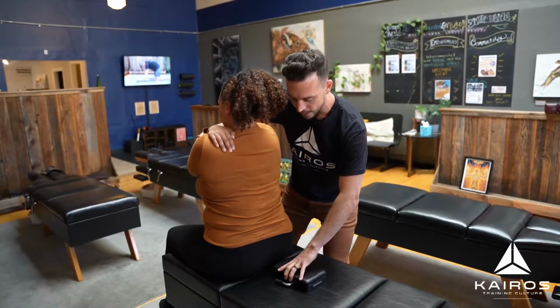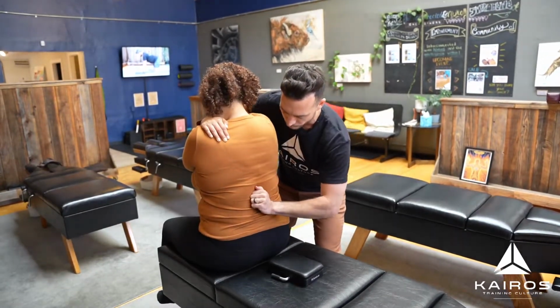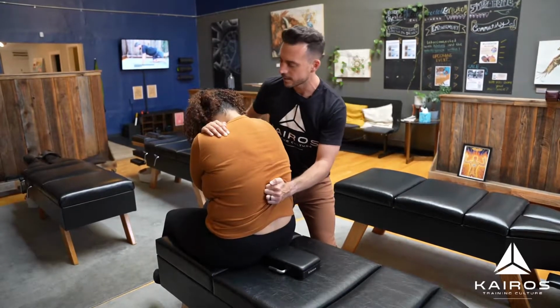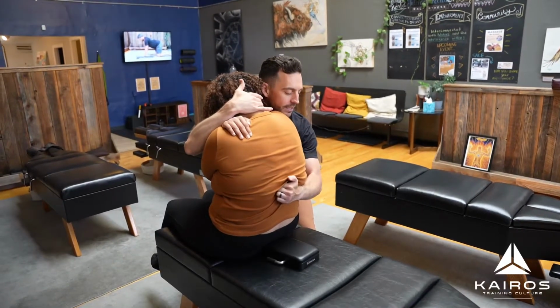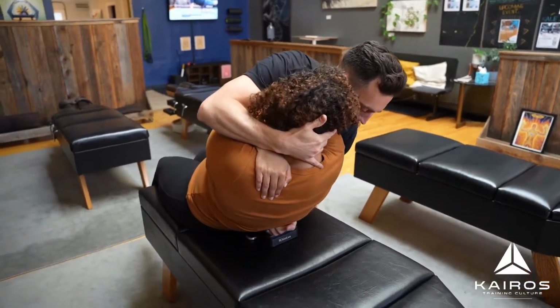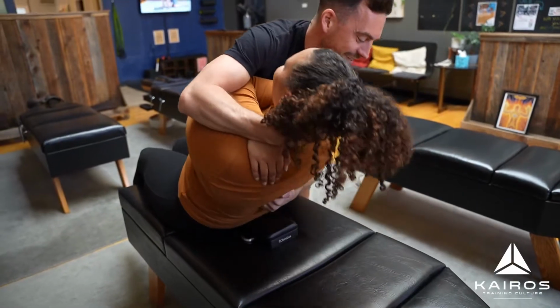So what I'm gonna do is line up the ChiroLux Spark here, because I'm gonna fulcrum this down onto that spot. I'm gonna contact L1 by going right below it, and then have you go down into flexion to open up those facet joints and the spinous processes. I'm gonna stabilize right behind her head so she can put all the weight into me while feeling safe and stable. And I'm gonna take a big breath in. I'm gonna come all the way down, fulcruming onto that Spark, and then allowing her shoulder blades and head to come back. Right there, nice.